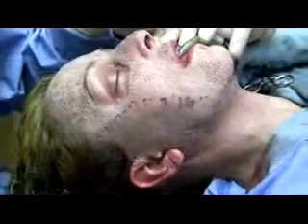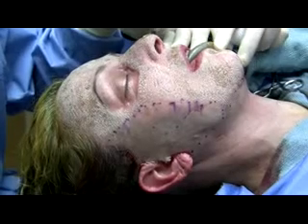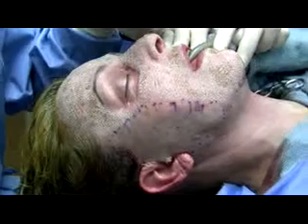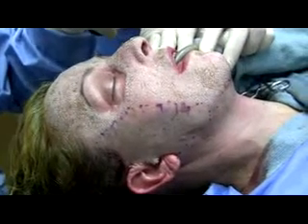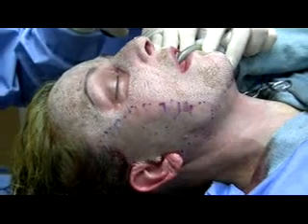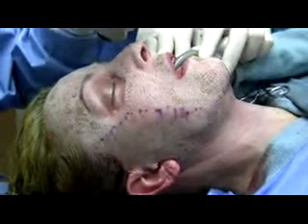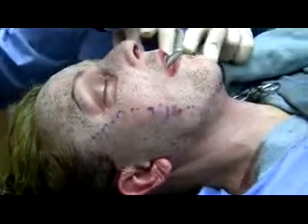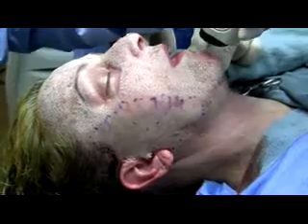Second laser pass. When laser resurfacing first began, people felt that you had to wipe the char off before doing a second pass. Otherwise it would form a heat sink. But I did the first human study on this with histology, published this a couple of years ago in the Journal of Dermatologic Surgery, where we did split face studies, debriding on one side and not the other. And actually that's not true about having a higher energy. You actually have a little bit lower energy. So we do not debride between passes.